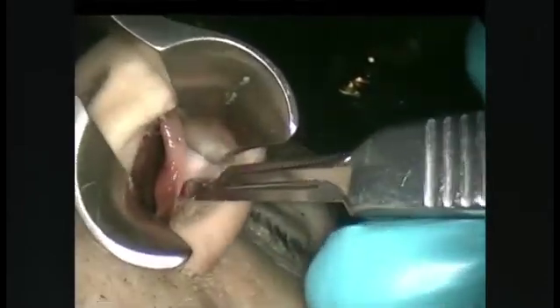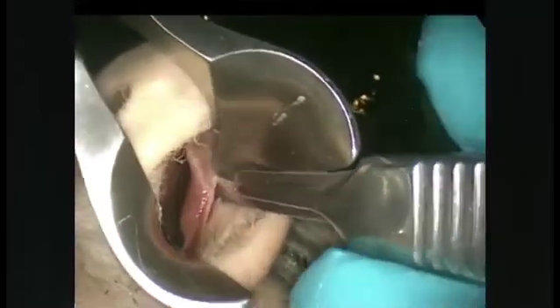So you have your nasal speculum in there. If you look carefully, you can see the caudal border of the upper lateral cartilage. The speculum is dilating the valve open. I'm using a sawing-like motion to open that intercartilaginous incision broadly. You use a Stevens tenotomy scissor then to undermine over the upper lateral cartilage. If you notice there's not much bleeding, this is a cadaver study. So I wish I could say it was all skill, but it's a cadaver.